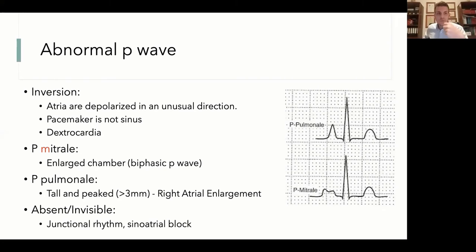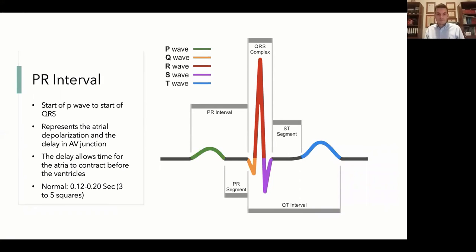If you see in lead 2 that the picture is not taken as it should, you will have a different result. That means that something is going wrong. That means that something is not functioning as it should.